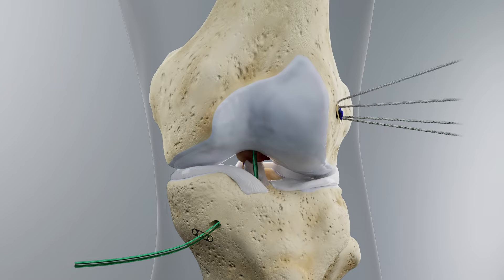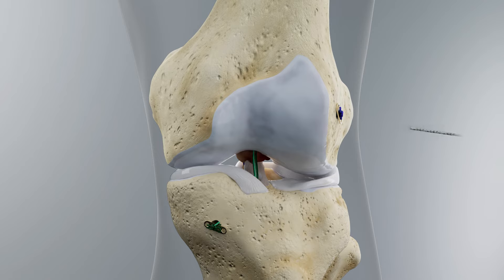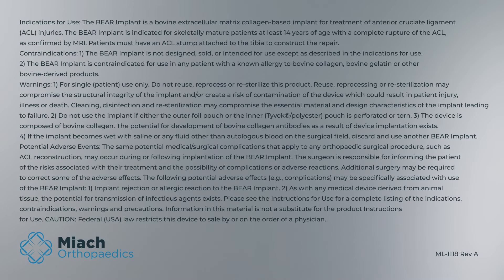Pull max tension on the cinch sutures and tie them down to the tibial button. Remove the toggle sutures and close the capsule. Wrap the knee in full extension with the post-operative brace locked at zero degrees.